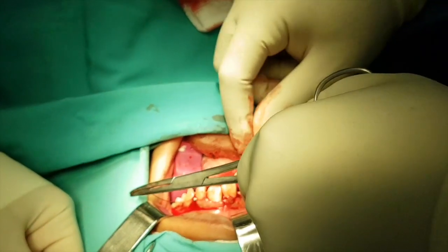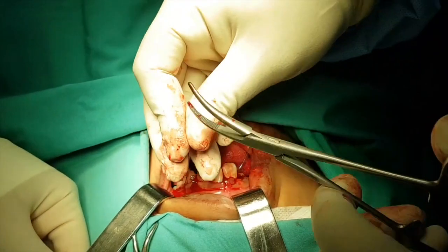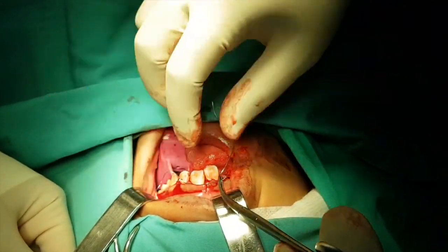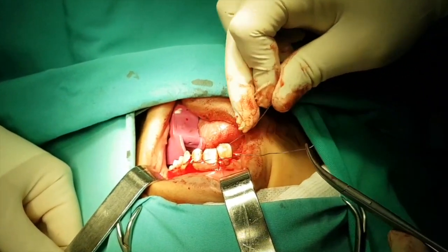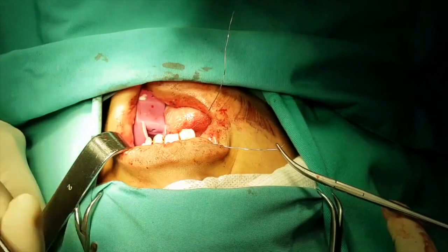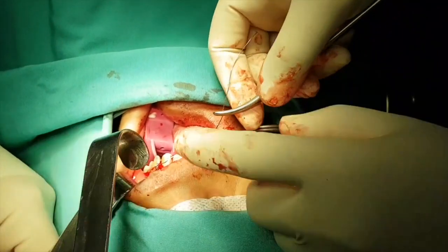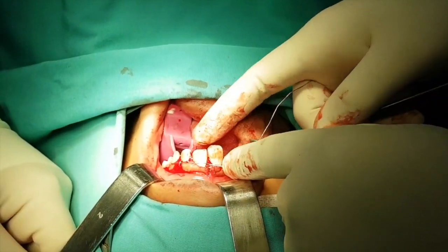As you can see here, a little bit of manipulation and experience is necessary to get that incisor edge in the right position. Don't panic — sometimes those teeth will completely avulse, but put them back in the socket. They are still viable. Certainly don't give up too easily when placing avulsed teeth. You can get some primary stability, but at the same time, avoid being too tight to the extent that there is too much rigidity in placement of these incisors.